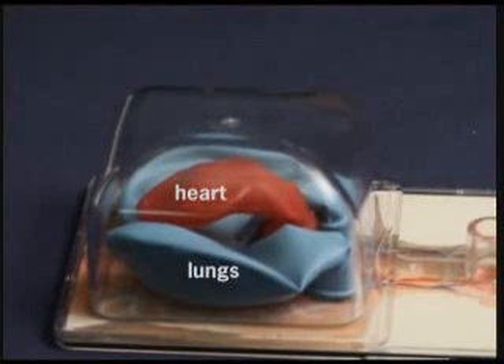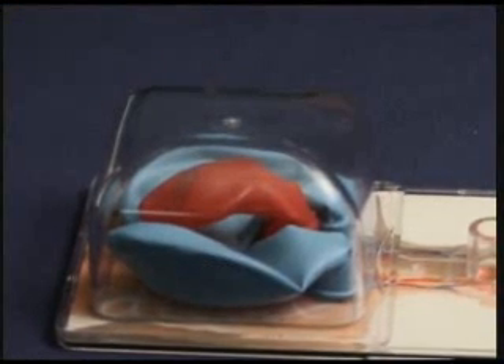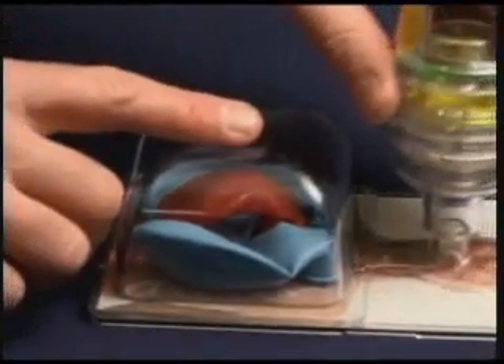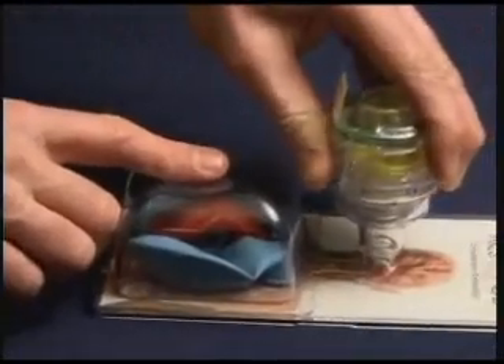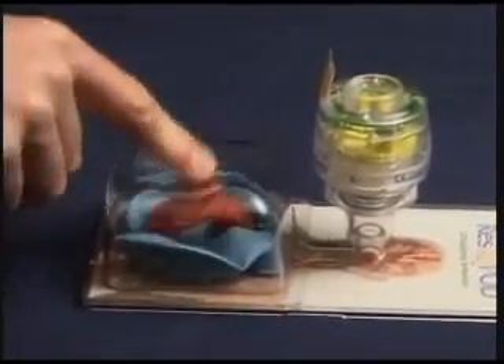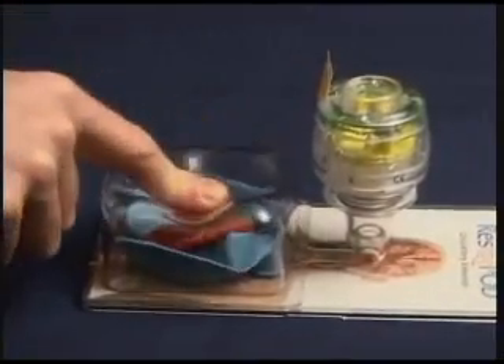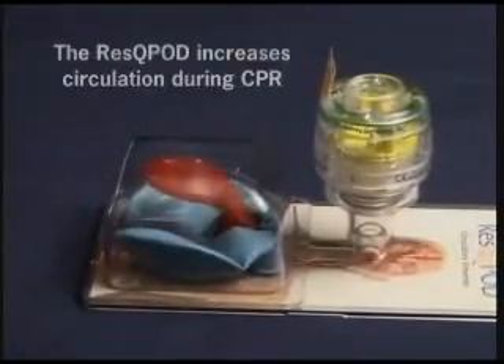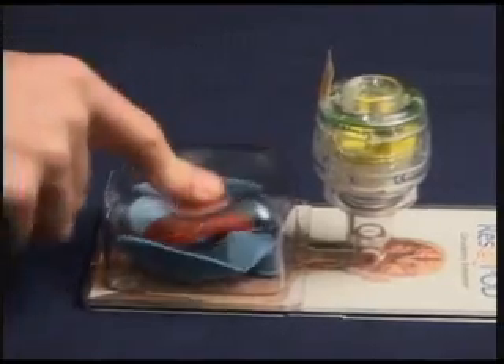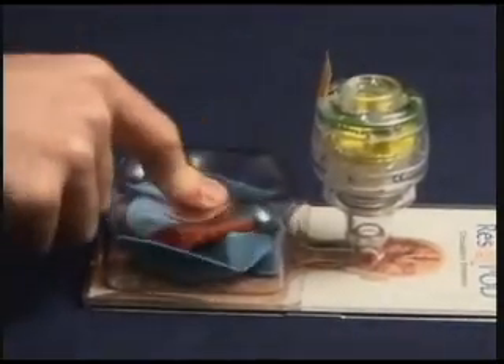However, standard CPR can be augmented by the use of the Rescue Pod, or Impedance Threshold device. This device can be placed on a face mask or, in this demonstration, on the endotracheal tube. Now when you compress the chest and allow the chest to recoil, the vacuum that develops inside the thorax is greater. This results in a doubling of blood flow back to the heart, and as a result, a doubling of blood flow to the brain.